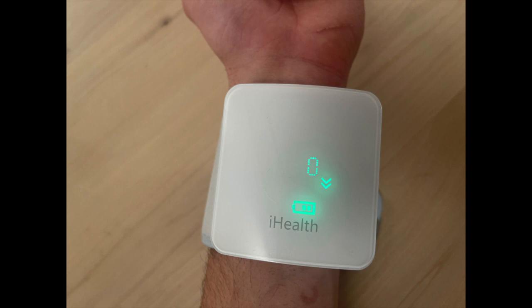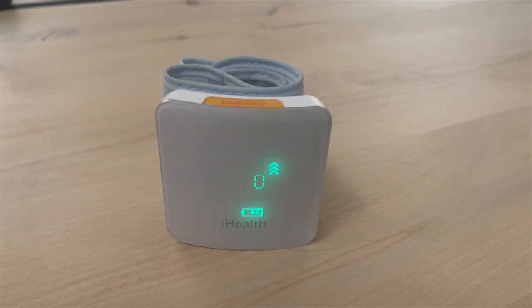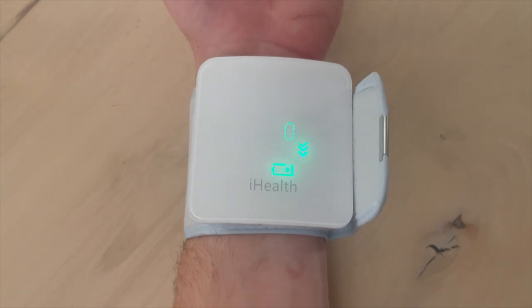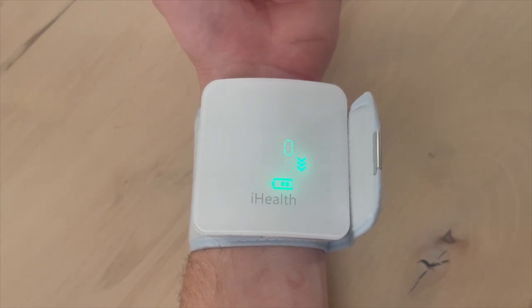Please remember, if you are a stroke survivor, the cuff should go on your unaffected arm. Please make sure to use the same arm for each reading. When the device is in the off position, click the start stop button once to take a measurement. The display should now show a zero, arrows or dots, and a battery icon. When you're ready, sit comfortably with your feet flat on the ground.